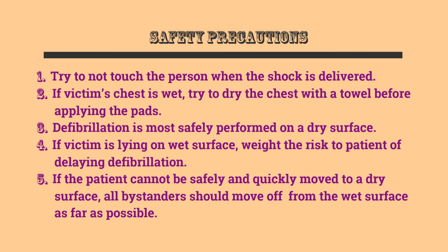If the victim is lying on a wet surface, weigh the risk to the patient of delaying defibrillation. If the patient cannot be safely and quickly moved to a dry surface, all bystanders should move off the wet surface as far as possible.